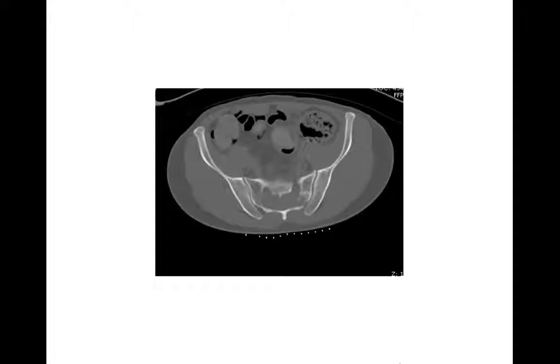Moving on to the sacrum and a brief differential for common lytic lesions there. Here we have a geographic lytic lesion taking up most of the mid-portion of the sacrum. This one turned out to be a metastatic lesion from a medulloblastoma of the brain. Metastatic lesions in general are one of the things you'll think about in the sacrum. Sacral lesions are often hard to see on radiograph — look for the arcuate lines and make sure you're seeing them all. Usually better seen on CT.